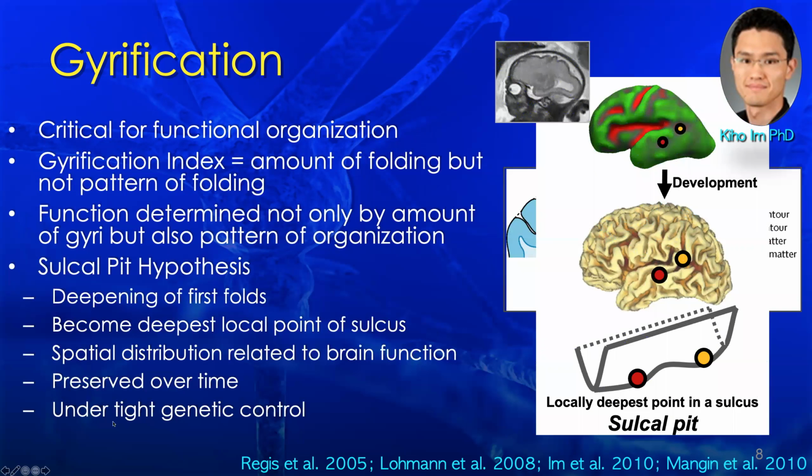So these locations of these sulcal pits emerge early in fetal life and are still there later in postnatal life, even into adulthood. Now, to use these sulcal pits to get evidence or to quantify gyral patterning, we key on the 3D position, area, depth of folding, and use a spectral matching technique.